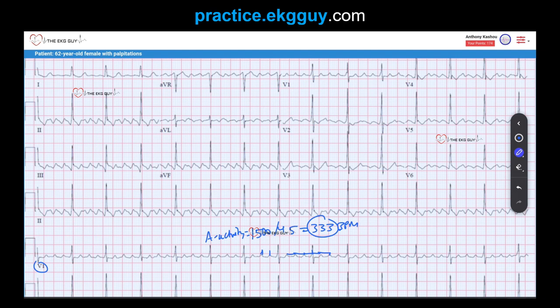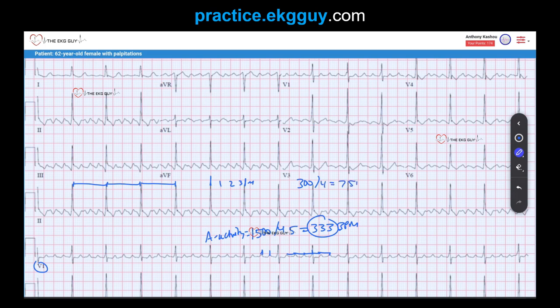The machine reported 85 beats per minute. Let's verify that ourselves. The R-to-R intervals are regular throughout, so it's a regular ventricular rhythm. Finding an R wave on a thick line, the next R wave falls about 4 large boxes away. So 300 divided by 4 gives 75 beats per minute, and 300 divided by 3 gives 100 beats per minute. The actual rate falls between those — the machine reported 85 bpm, which fits.